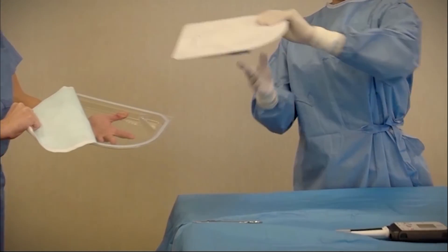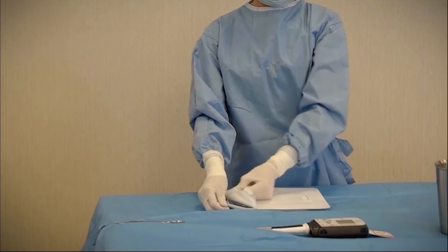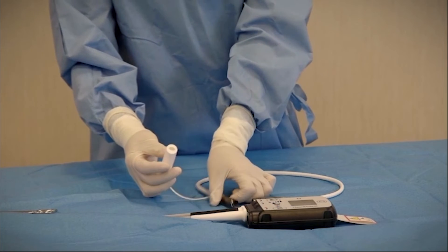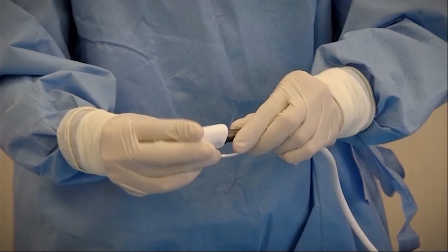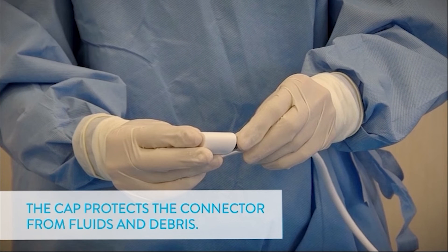Next, open and pass the modular cable inner tray onto the sterile field. Remove the cable from the tray and push the modular cable cap onto the end of the connector. Press firmly until the connector bottoms inside the cap. The cap protects the connector from fluids and debris.